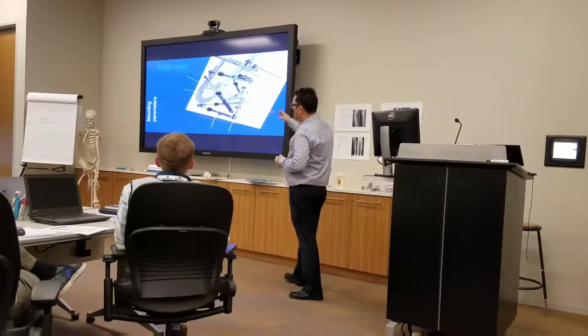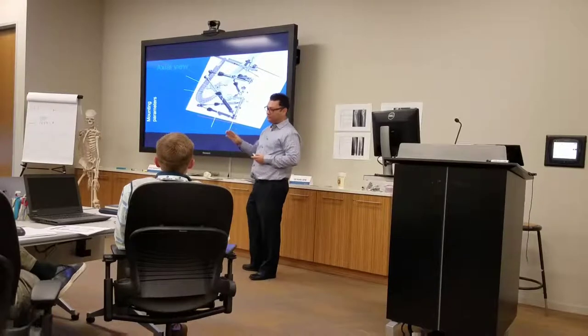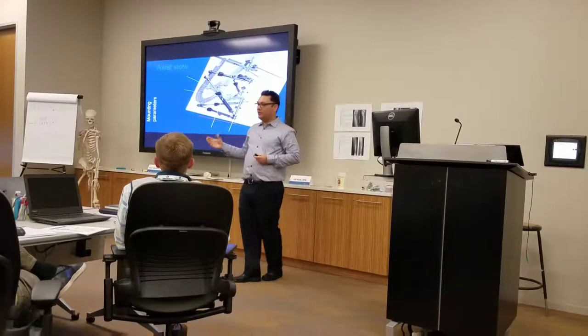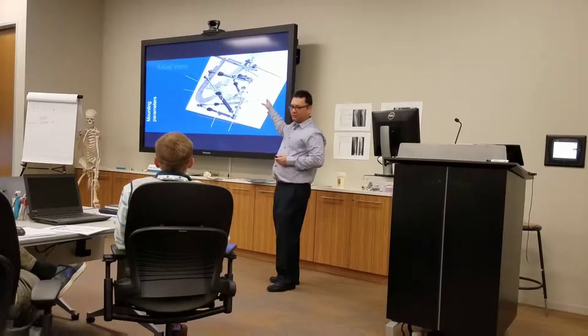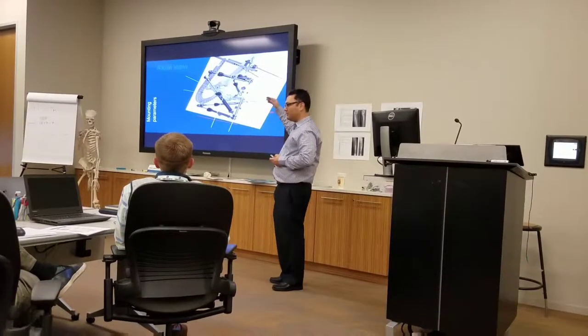So with the butt frame and also the mitre frame, for the foot portion, use a distal reference. Why use a distal reference? Because it's much easier to take all your measurements with a distal reference. That means you can measure that second metatarsal, you can measure that first metatarsal.